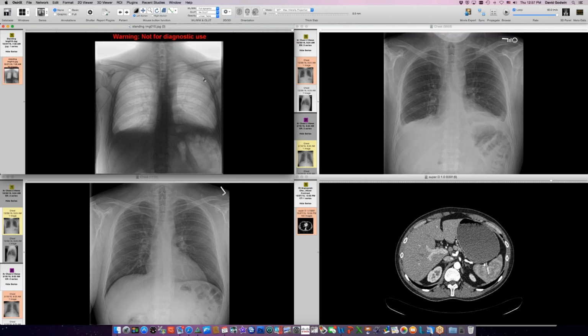Despite the fact that he has normal muscle thickness, he's got reduced muscle function when we look at his diaphragm muscle. So this is the first case I've seen of myositis with profound diaphragm dysfunction like this. That's impressive.